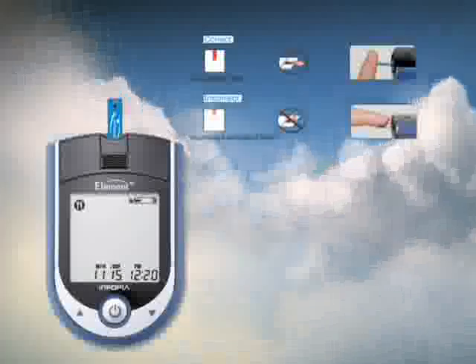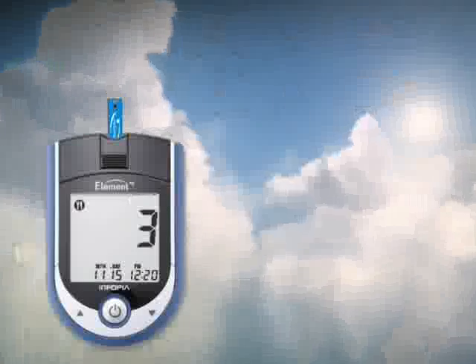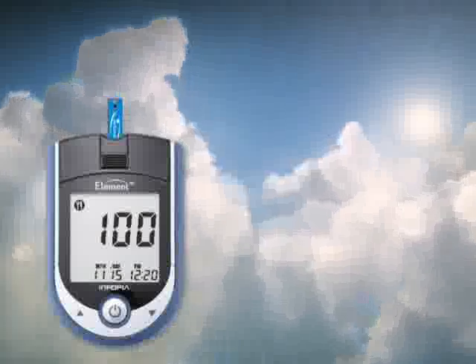Place the edge of the test strip into the drop of blood. The blood will automatically be drawn in the test strip channel. Your meter will begin counting down from 3 to 1 and your blood sugar result will be displayed.